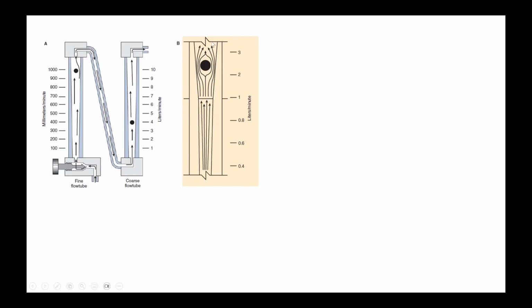Then it will expand suddenly much broader, and it will deliver both the low flow as well as high flow within the same tube. So this is a constant pressure variable orifice flow meter with a two tube design, and this is called the dual taper design. Double taper or dual taper machine to deliver both low flow and high flow in a single tube.